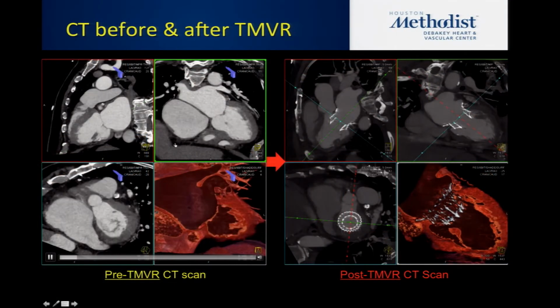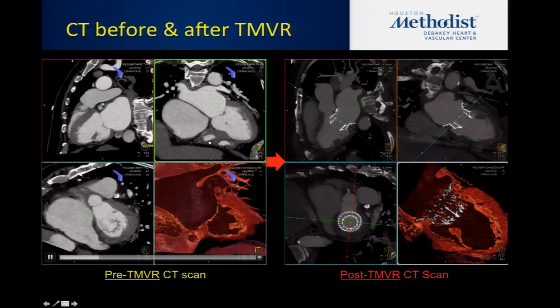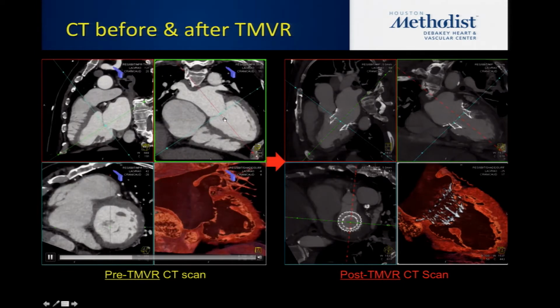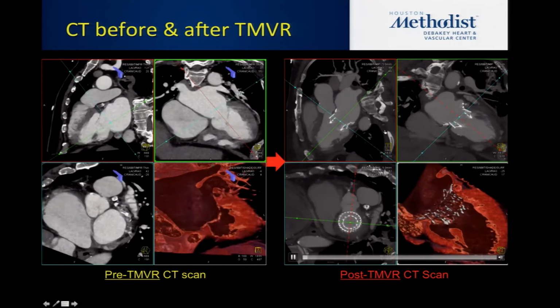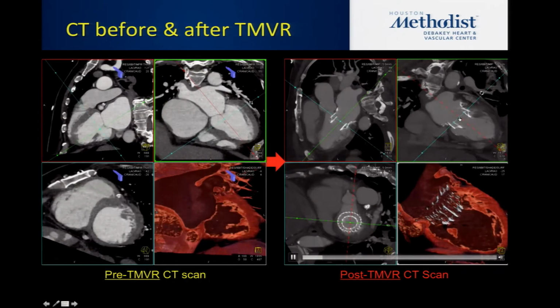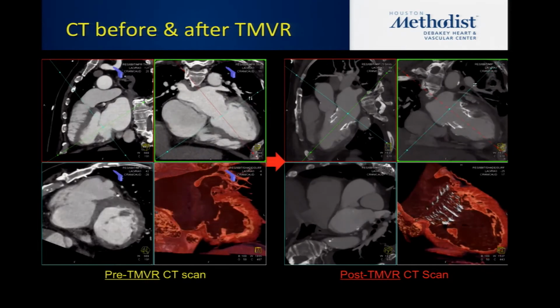This is interesting because this is the CT. So Dr. Q, this goes to your point. This was the pre-procedural CT. Note, get a rough sense of the EF and the annular descent. And then this is a CT post-implant. The annular motion is reduced, but there's still a descent. But the ventricular contraction looks quite different.